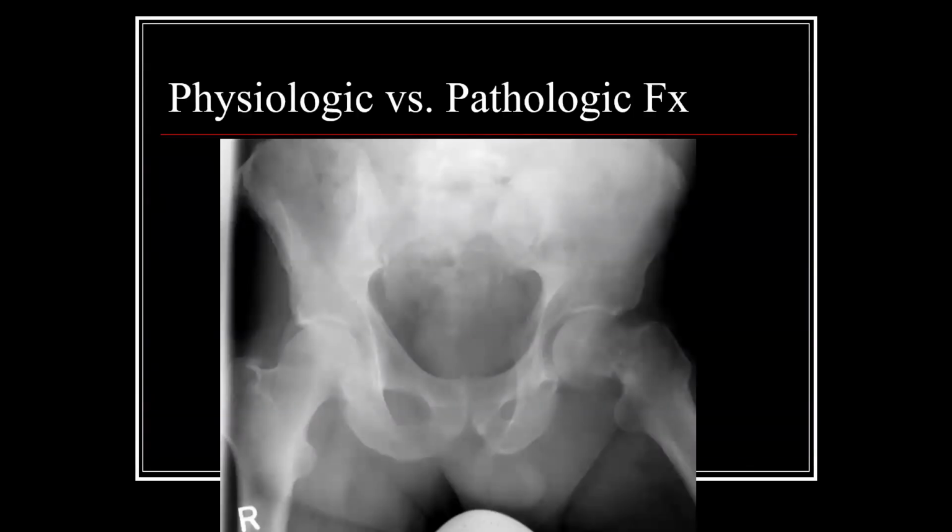Now, radiologically, they're usually sensitive to when something's a pathologic versus a physiologic or traumatic fracture. But we can see here that these two hips don't look quite the same. And we might see that there's a little bit of rarefication here, so we might be suspicious that something's going on.